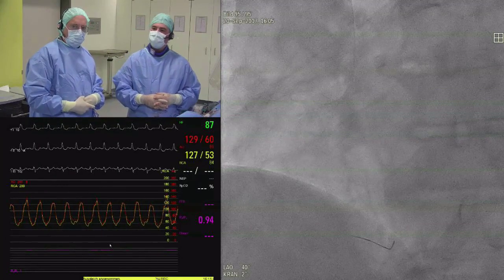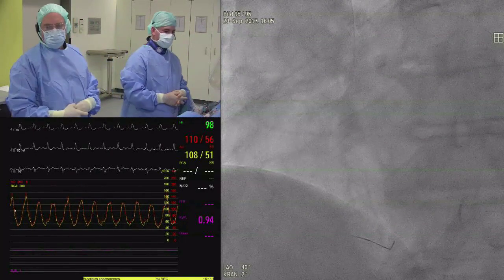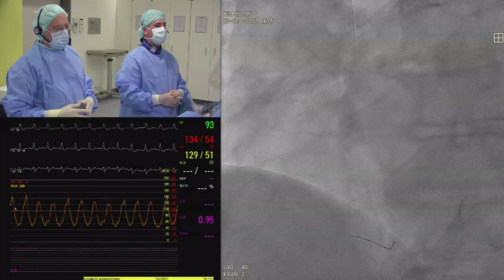So I think we go with the adenosine now, please. Did you give some nitro? We already did give 2 times nitro, yes.